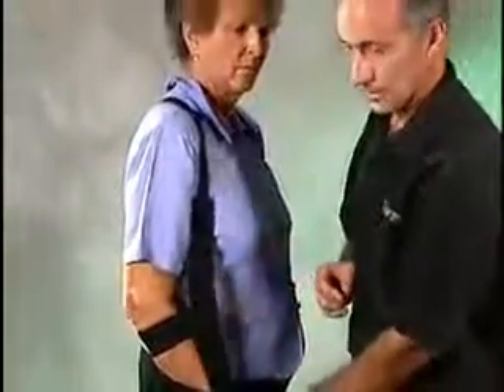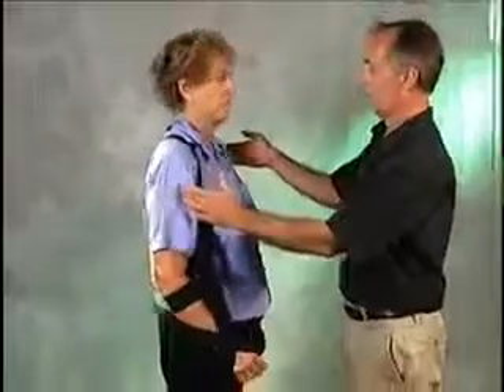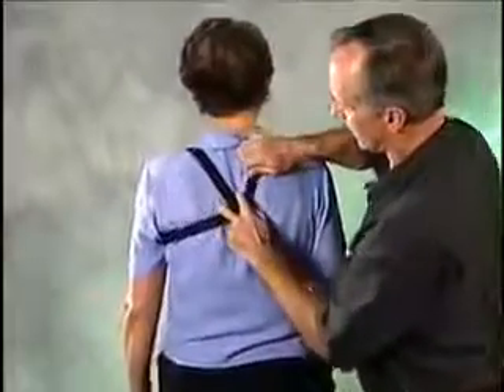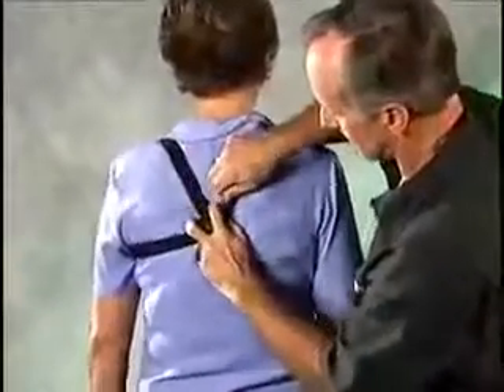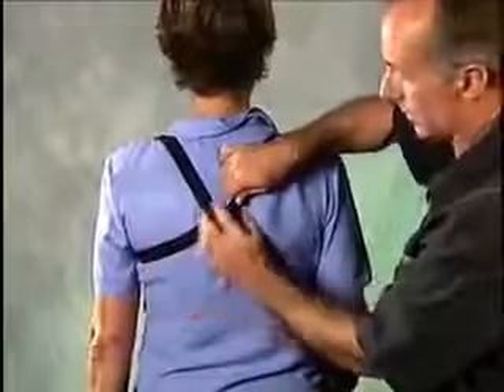You want to have 30 to maybe a little less than 30 degrees of flexion at the elbow. The four-tab buckle here, you want to have centered over the spine, and you want to take it down distal as far as you can. This really takes the pressure off the contralateral axilla.